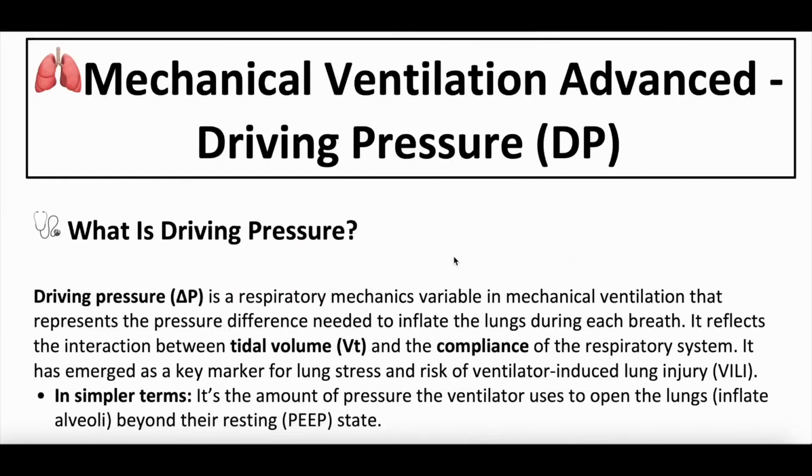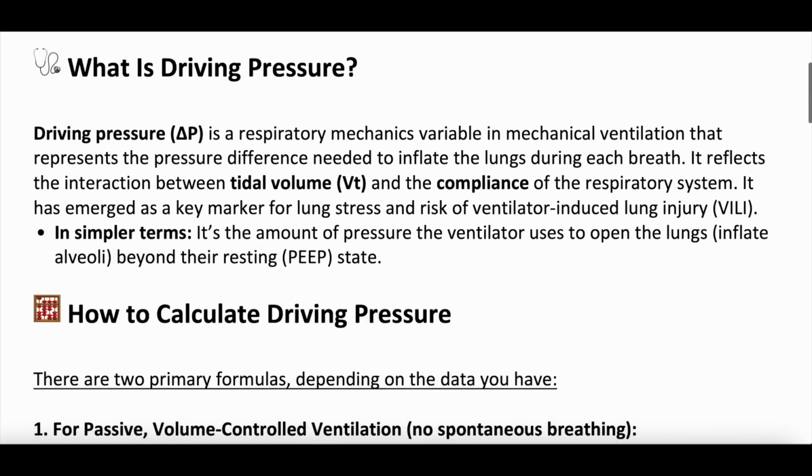Let's dive into driving pressure. What is driving pressure? Well, driving pressure is a variable that we can determine when someone's on mechanical ventilation. It represents the pressure difference needed to inflate the alveoli during each breath. And we're going to come back to that as a concept. It kind of represents this interaction between tidal volume and compliance of the respiratory system. And it's really emerged as a marker for lung stress and possible risk for ventilator-induced lung injury.